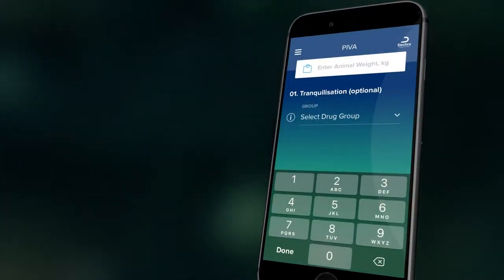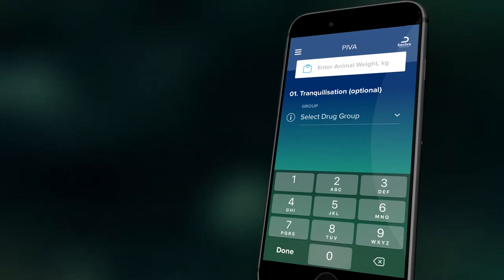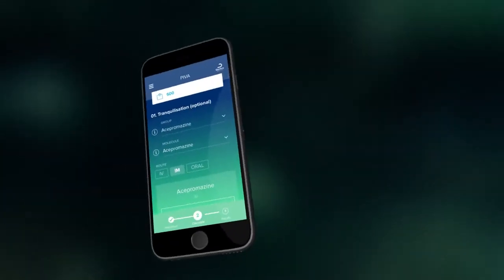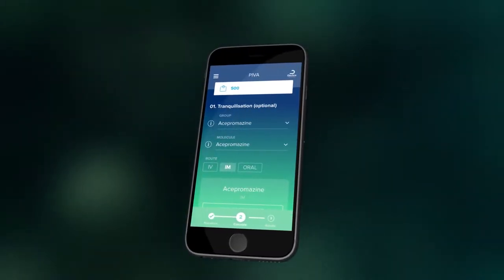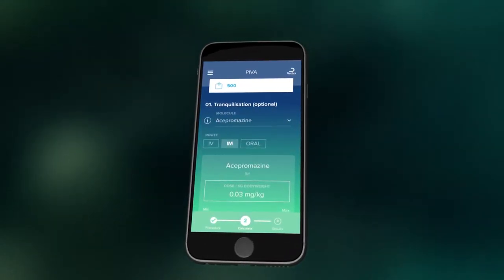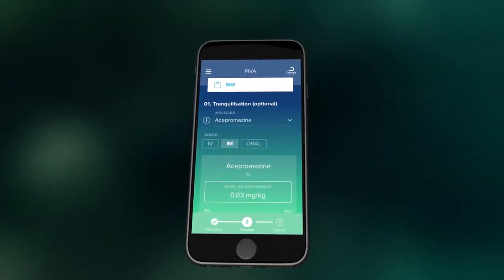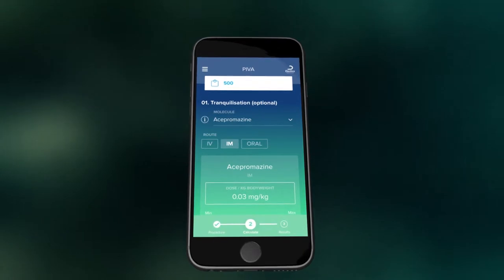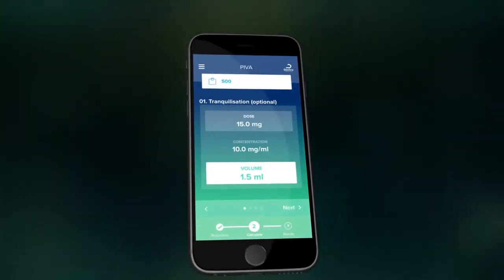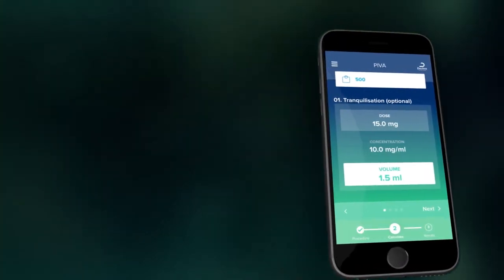We will use a PIVA general anesthetic protocol for this example. First, enter your patient's weight in kilograms. Tranquilization is optional. If you wish to use a tranquilization agent, then enter the molecule you would like to use and the route of administration, then press next.